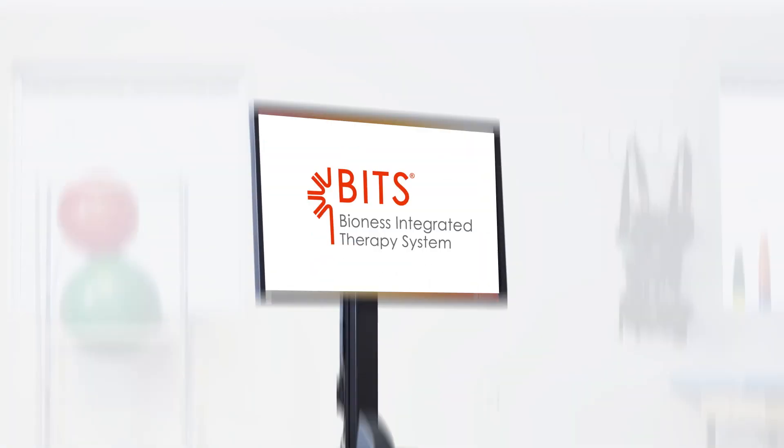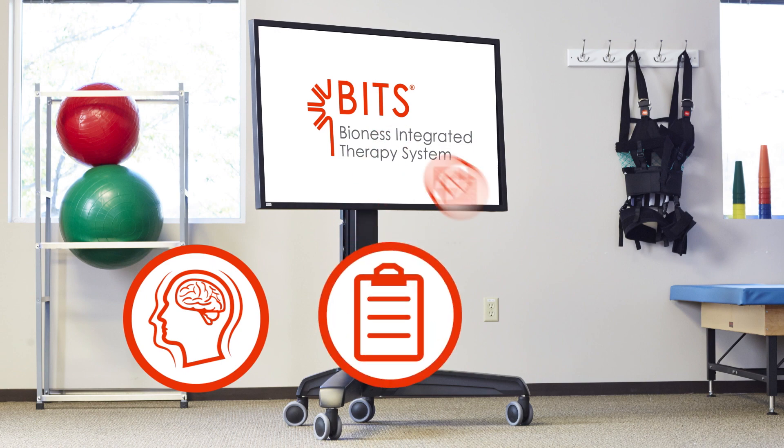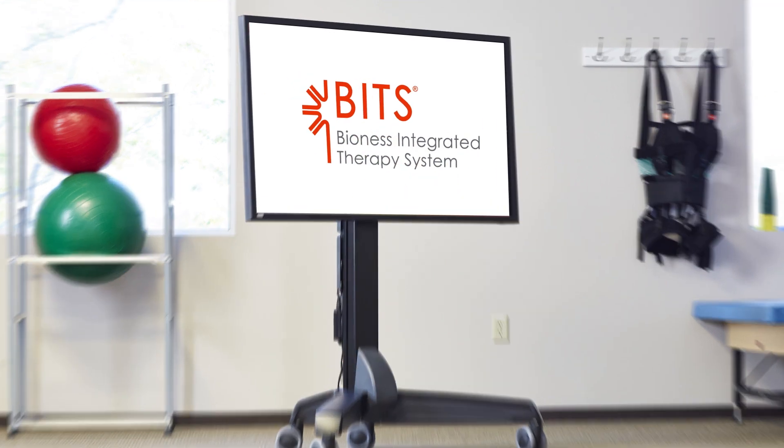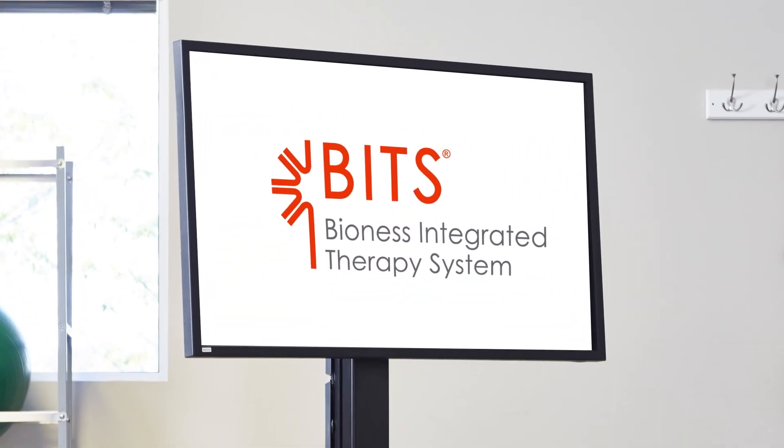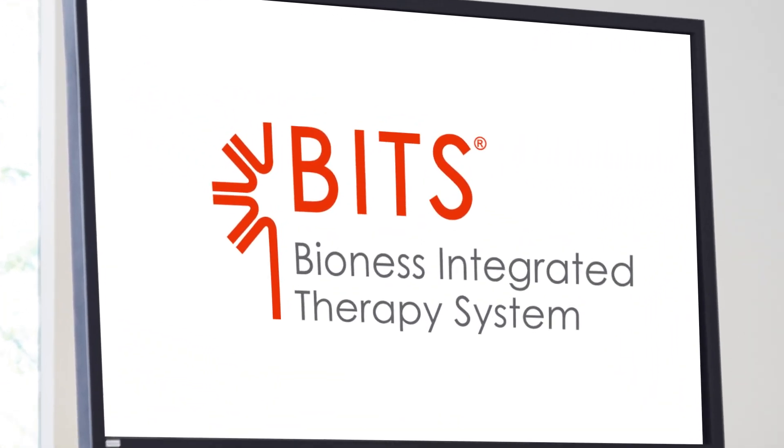BITS was designed to challenge, assess, and track patient progress across the continuum of care, all in one streamlined and easy-to-use solution.